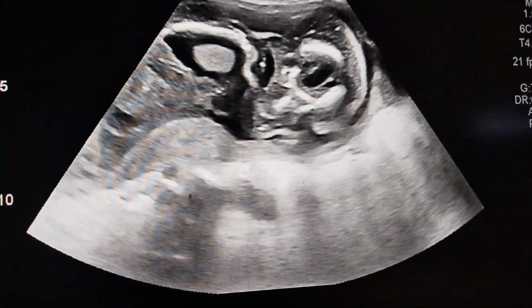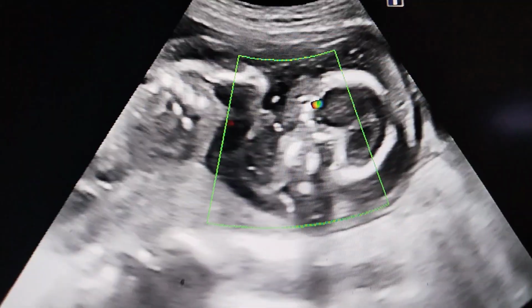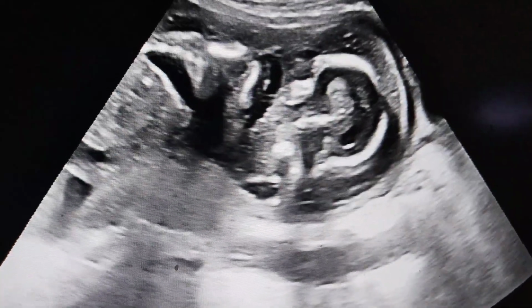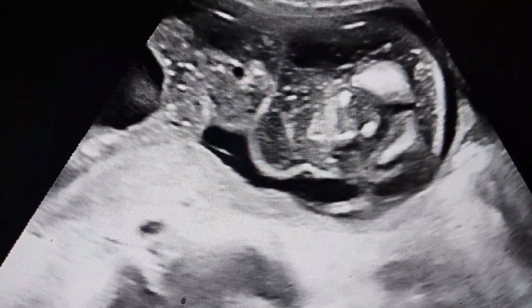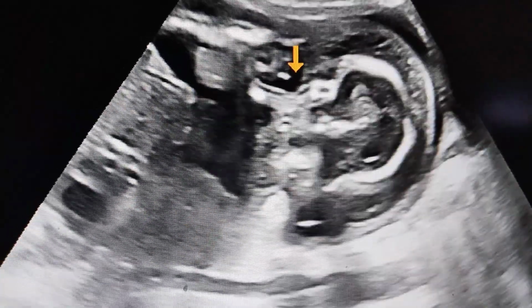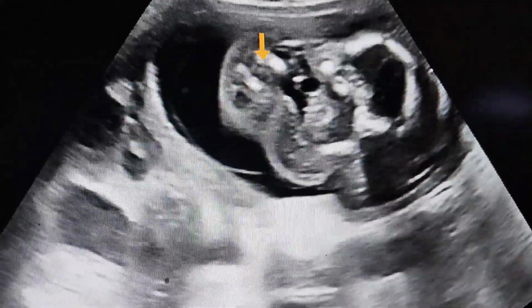Here this is the neck of the fetus, and we can appreciate this septated area. This is the neck of the fetus, and the septated area is present on both sides of the neck. So this is the cystic hygroma.